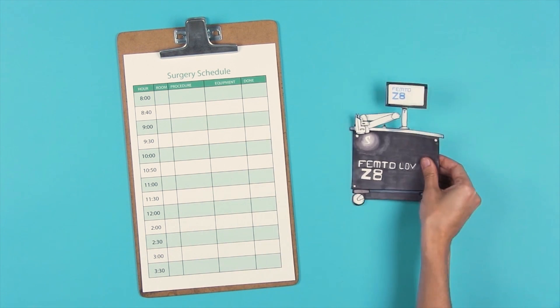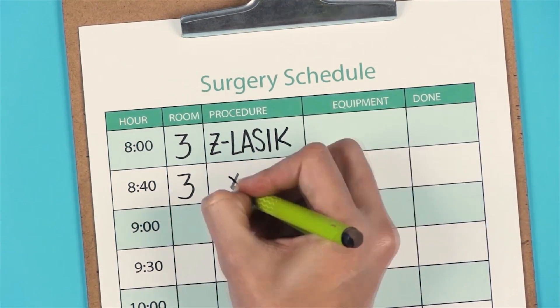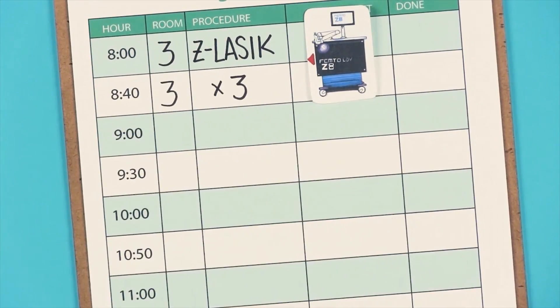We have three rooms, four procedures, and only one Z8. So, from 8 to 8:40, we do three Z LASIK procedures at room 3.